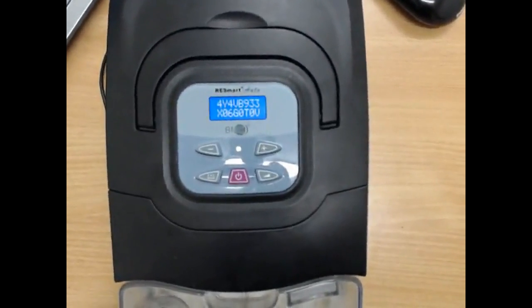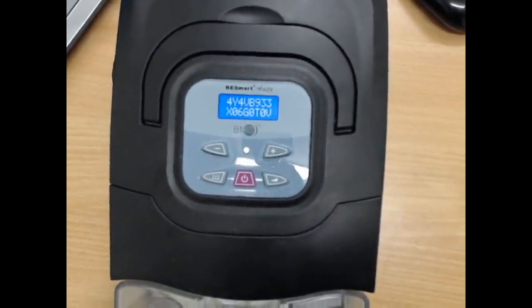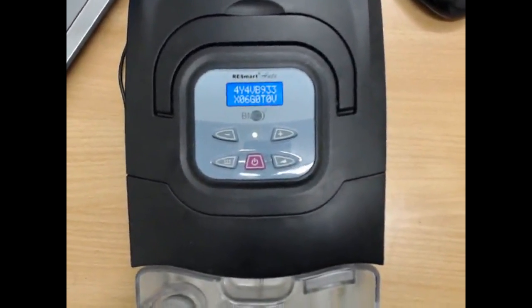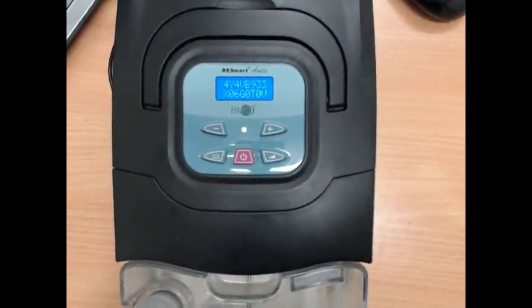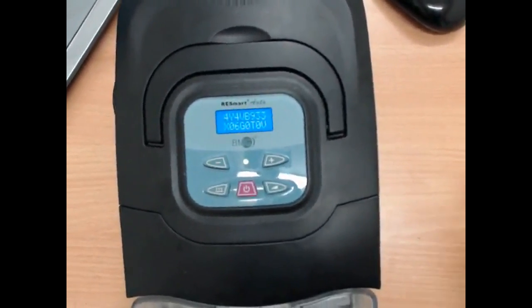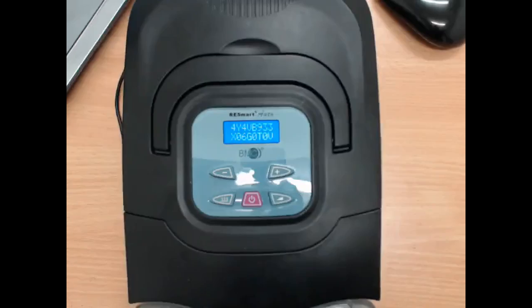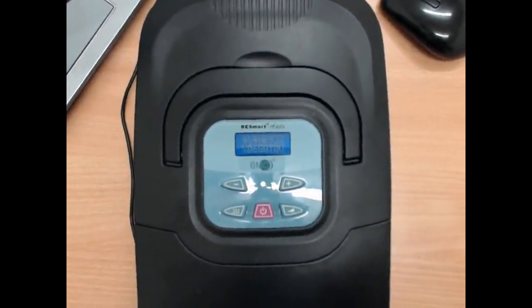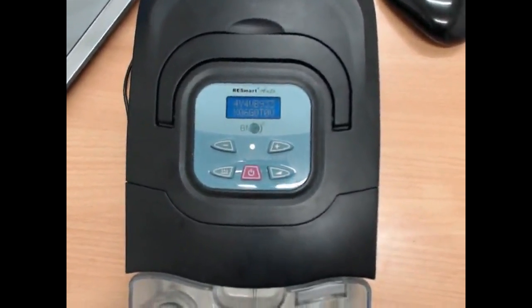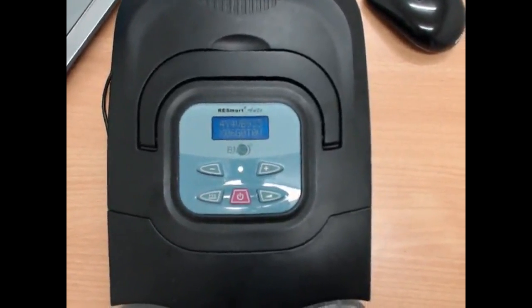Once you've done that, you can go to your computer and open up a browser, and in the URL at the top of the browser you type in www.bmc-icode.com, and that will open up an online application where you can put in these I codes. You can type them in and generate a report which will give you 30-day average, 7-day average, and last night's information about how you were sleeping, how you were breathing, what the pressure was doing, and all the rest. So it's a really nifty way of getting your data off the machine.